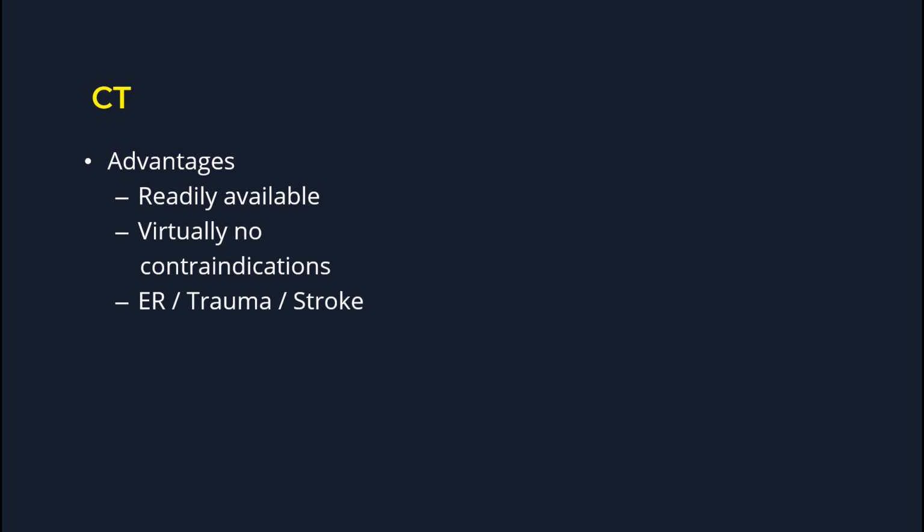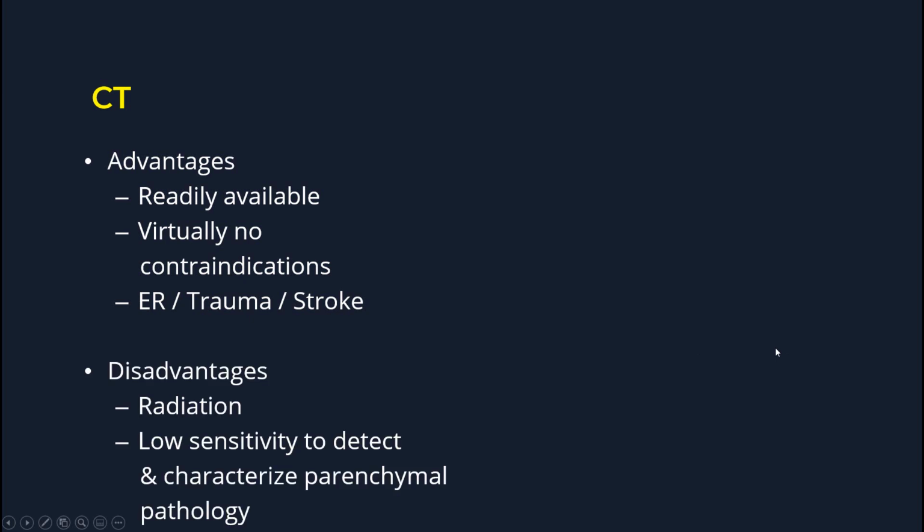Finally, what are some of the advantages and disadvantages of CT? Advantages include that this modality is readily available, it's very fast to perform, and there are virtually no contraindications, and this combination makes it excellent in the emergency room setting, in the setting of trauma, and in the setting of stroke. Like every modality and everything in medicine, CT has disadvantages, and some of those include the fact that it utilizes radiation and the low sensitivity to detect and characterize parenchymal pathology.